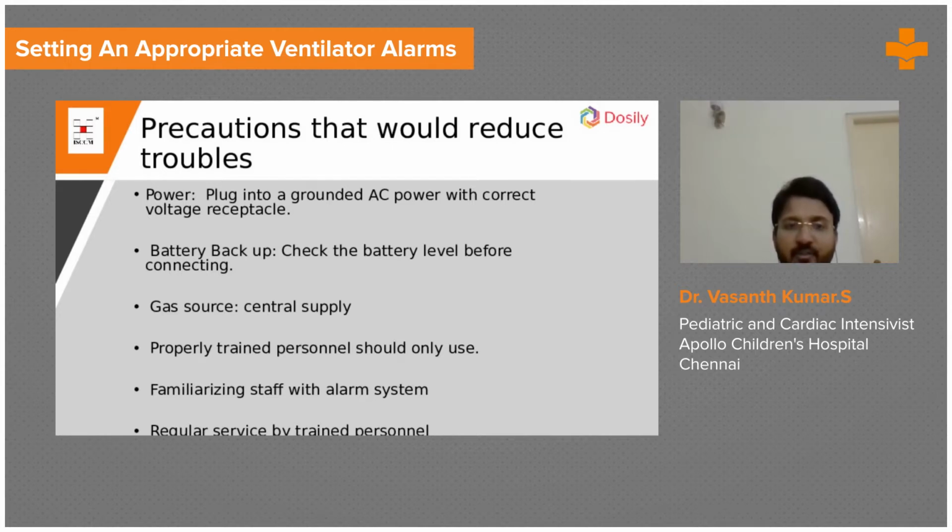Where is the oxygen source coming from? How to do the connections? They should be aware of it. They should also be familiar with the alarm systems, and all the machines and equipment have to be regularly serviced. By this you can come down on the general troubles.